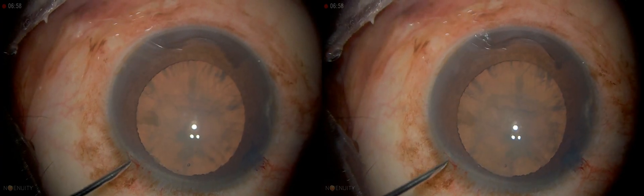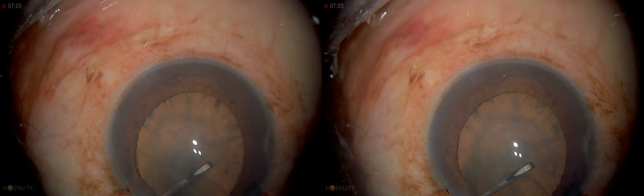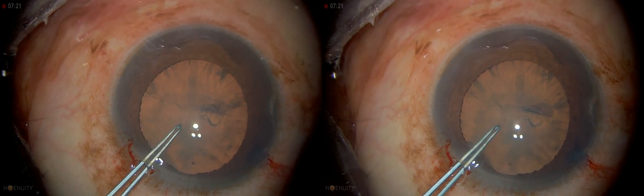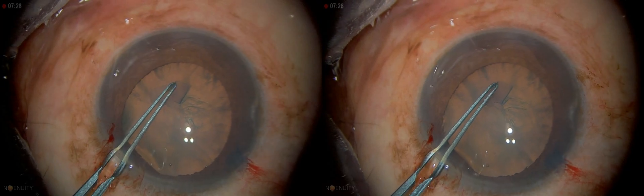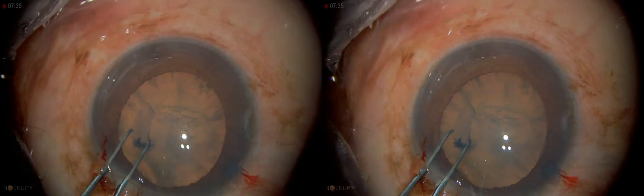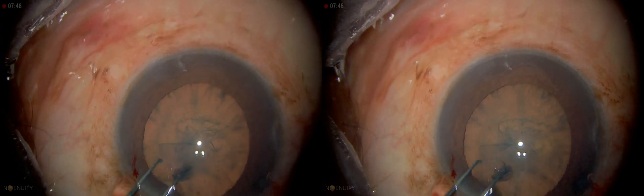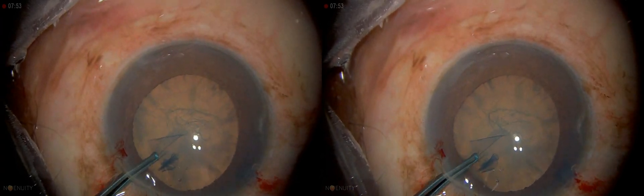I like to start in the center, and I like to go radial. We enter here in the center, go radial, and then lift up a little bit to get that turned over. Now we go to our Utrata forceps. I like to re-grab every two to three clock hours. Pull a few clock hours — see how I keep this turned over. I'm not grabbing here right next to it; I grab about a millimeter away. See how this is actually not coming with the rest of the capsule — I usually free this up. Then I re-grab, leaving it turned over the whole time. You can turn your flap around.